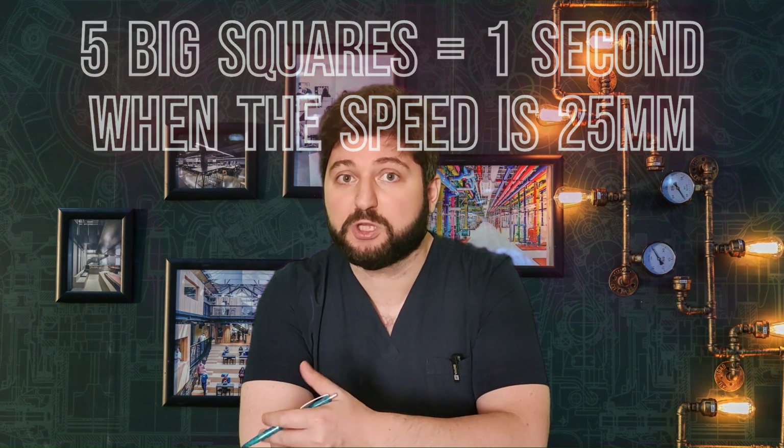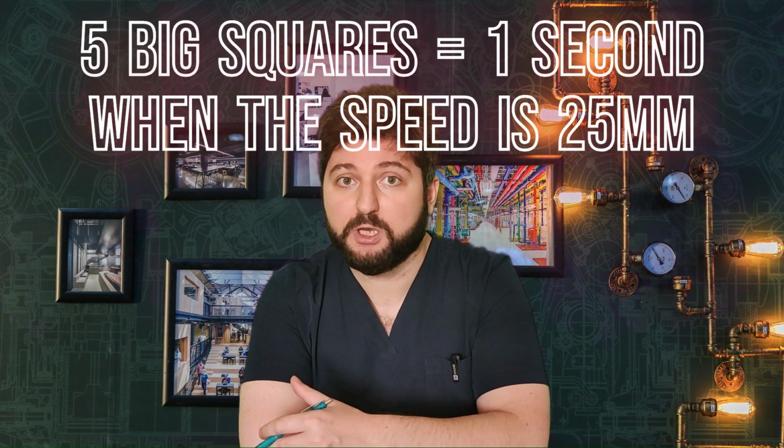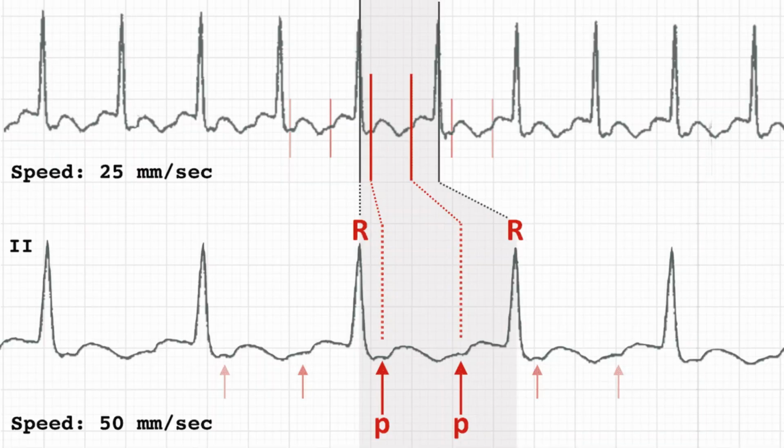Knowing this information, I can calculate the heart rate of a patient. Because let me show you again 2 ECGs. One is 25 millimeters per second, another is 50 millimeters per second. They are the same ECGs, again, in the same patient, done at the same time. But you can see how much different they look from one another. So, before you start doing anything, guys, always check the speed and voltage of ECG. Is it calibrated correctly or not?